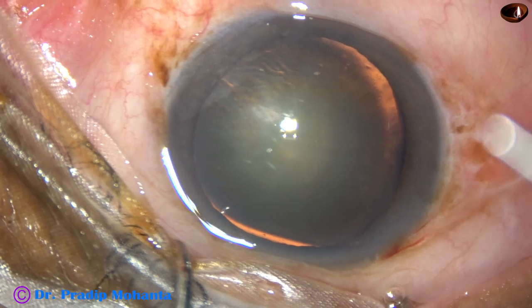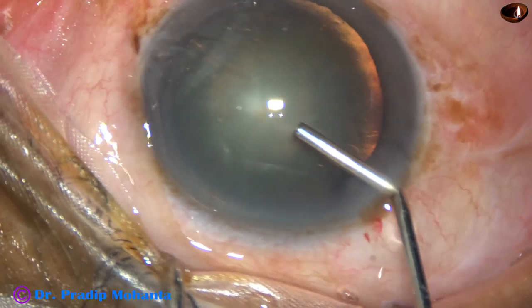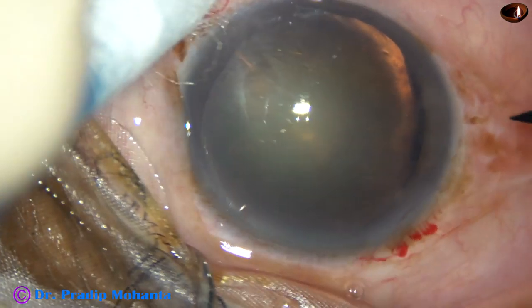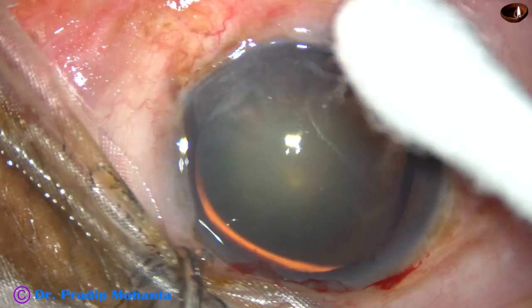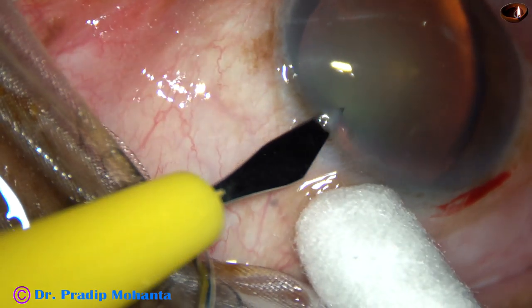I have taken up this case for surgery. The main incision has been placed at 11 o'clock. Viscoelastic is injected into the anterior chamber. One side port is made at 8 o'clock and another side port is made at 2 o'clock.